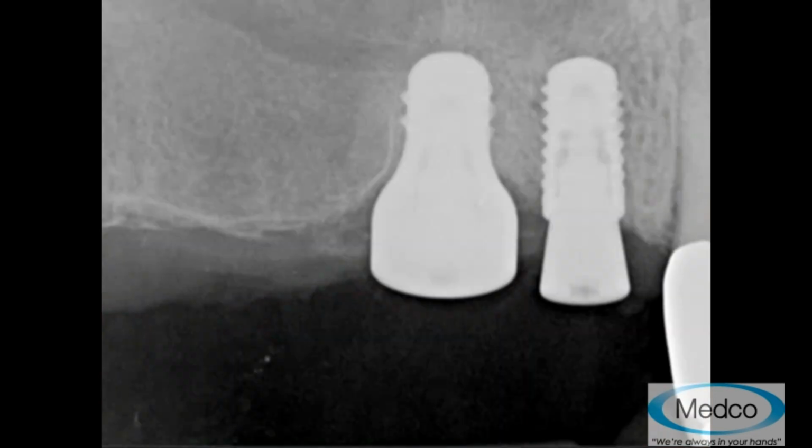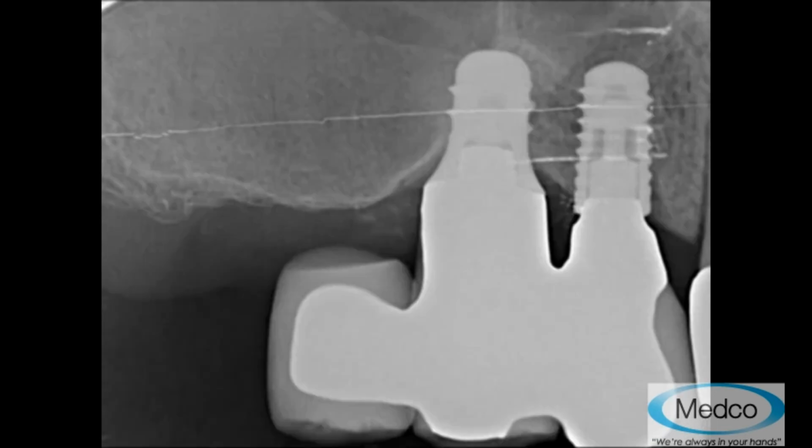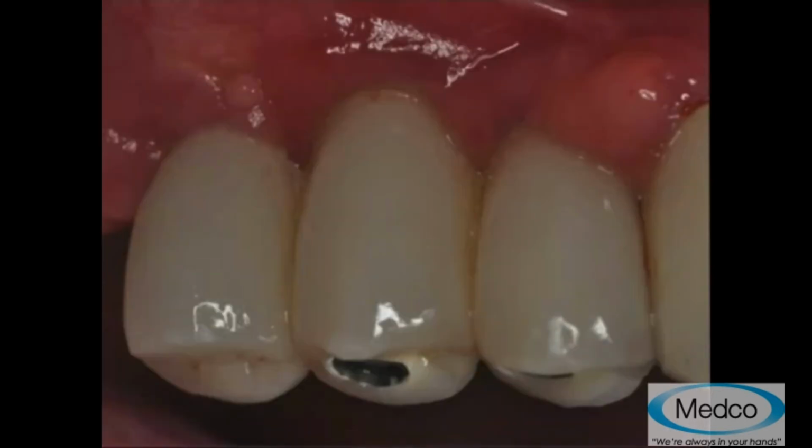You can see good bone stability. He had no posterior teeth beyond this, so doing a cantilever was what this dentist decided to do. Final restoration at about 1 year post-treatment.